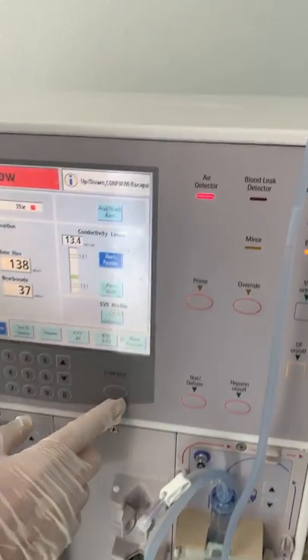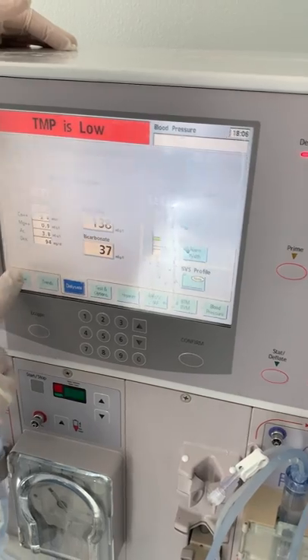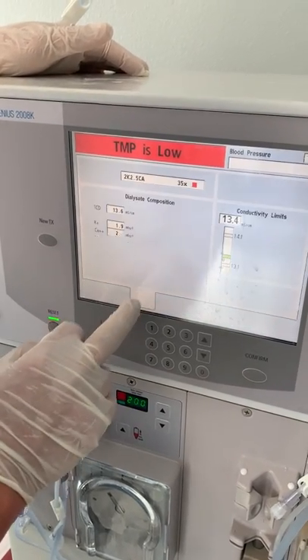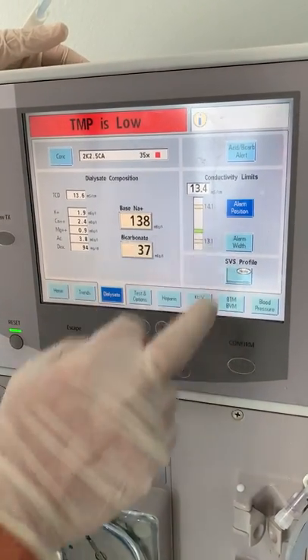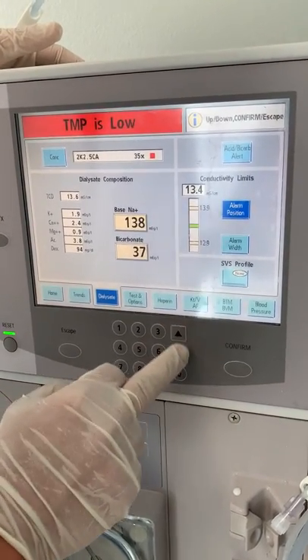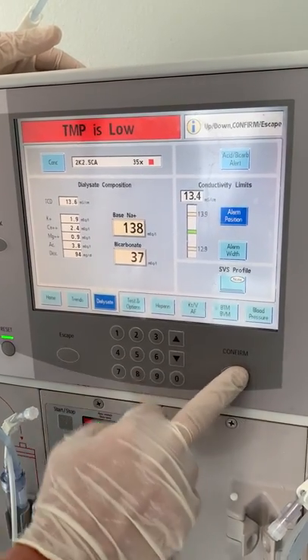To adjust, press Alarm Options, hit Confirm, then press Alarm Options again and hit Confirm. Use the up and down arrows to put the value right in the middle, then hit Confirm.